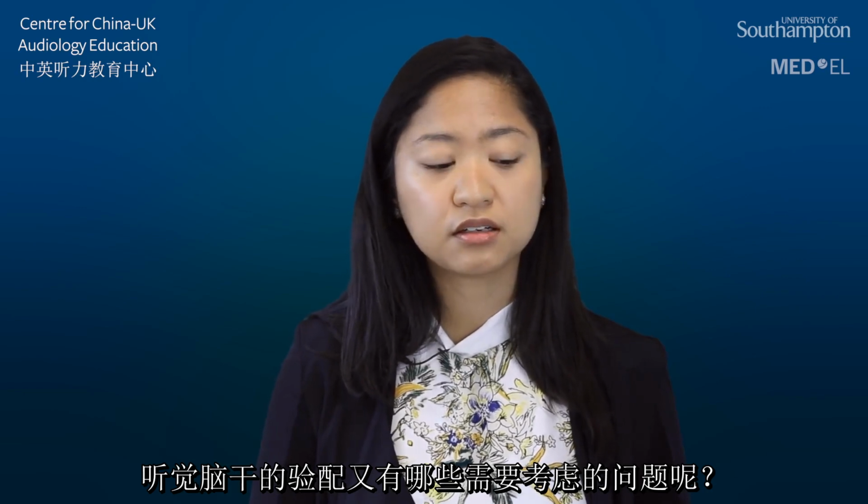Now, what are some fitting considerations when programming an ABI user? Similar to programming a cochlear implant user, when you program an ABI user, you also need to obtain thresholds and MCLs, or most comfortable loudness levels, and these are used to form a map or a program for that patient.